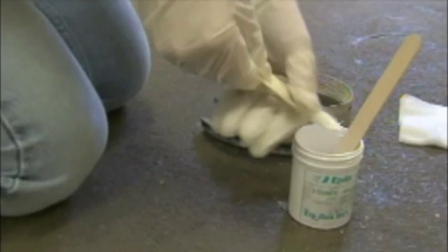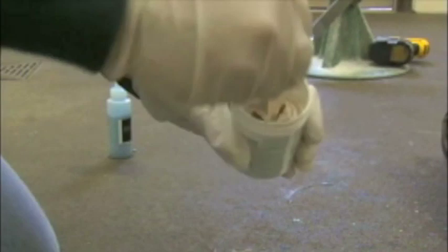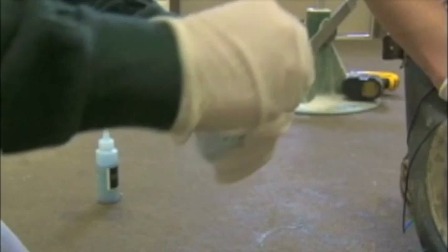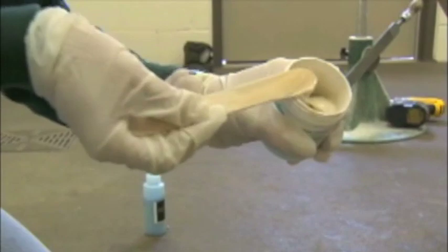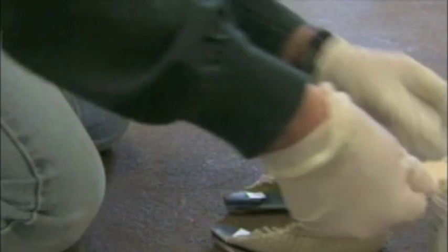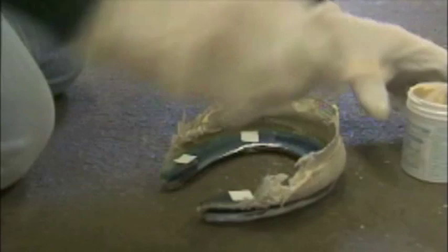The good thing about these indirect gluing methods is that you can wrap the foot up with plastic and set the foot on the ground, and the glue can cure on the ground while the horse is bearing weight. You don't have to hold it up the whole time, which makes it a little easier for sore-footed horses that don't want to stand on one foot too long. Make sure to get the glue well mixed so the hardener is evenly distributed throughout. I think a lot of guys that don't have luck keeping glue-on shoes on just don't mix the glue thoroughly enough. It's real important to get that glue mixed thoroughly, as well as the technique of gluing it on.